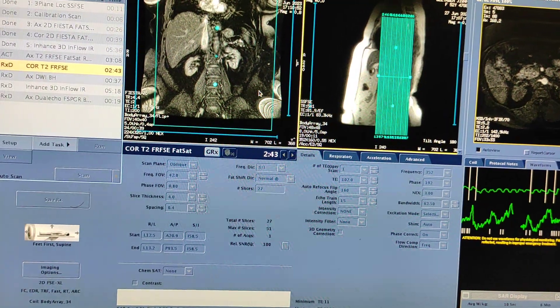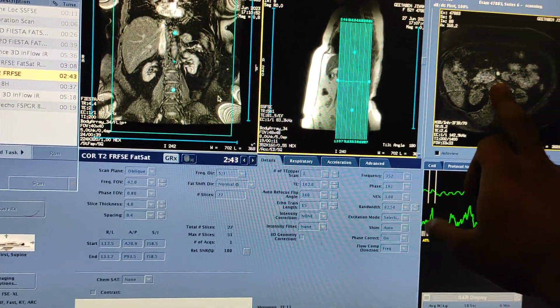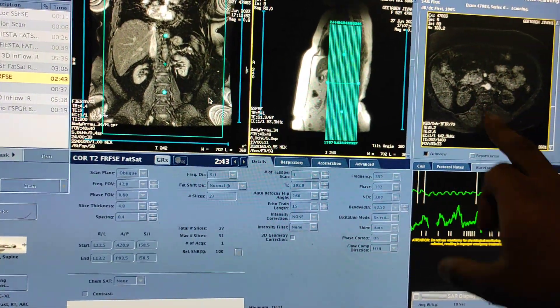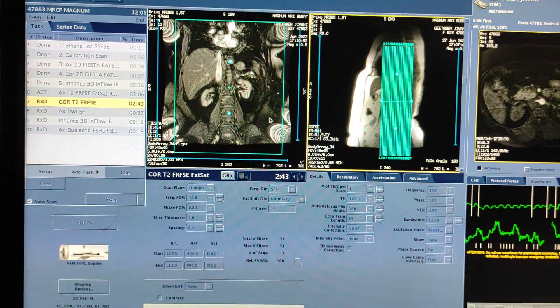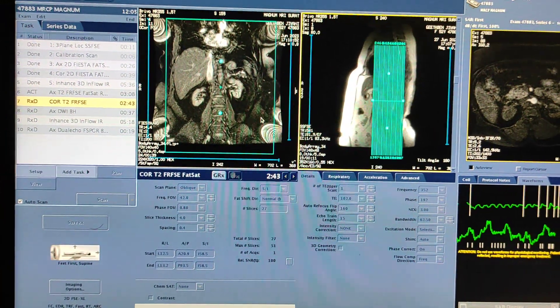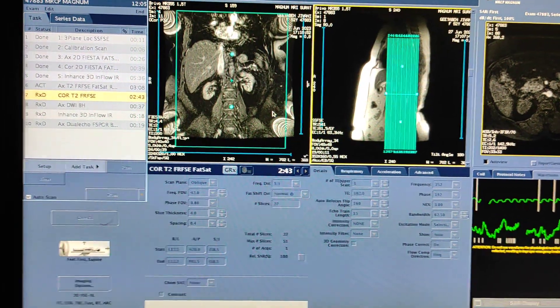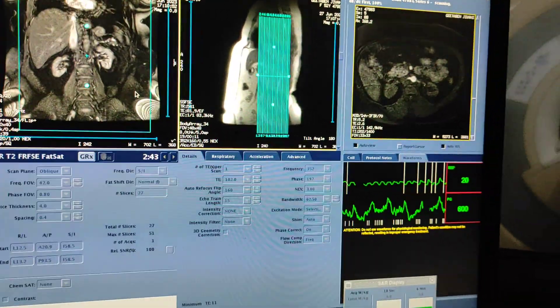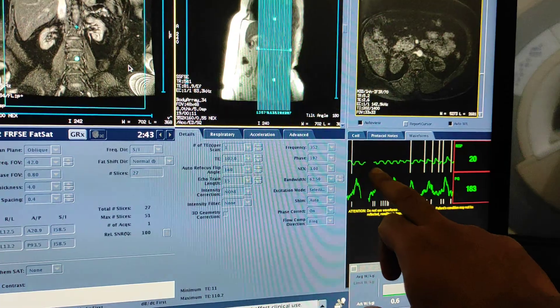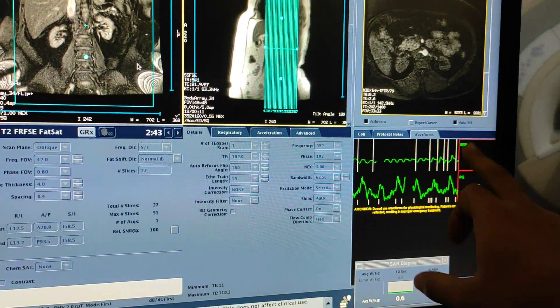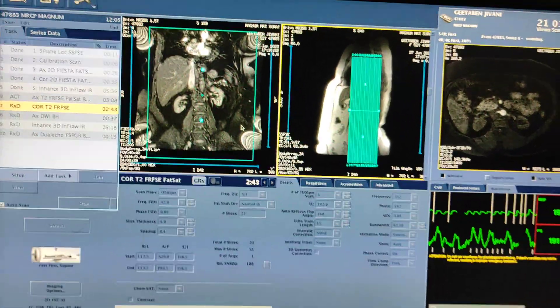Whenever you are doing this renal angio scan, first of all you have to scan the non-contrast angio sequence, then after that you scan the routine sequences — the axials and coronals. The patient is breathing properly, so respiratory gating is okay and the scan is going smoothly.